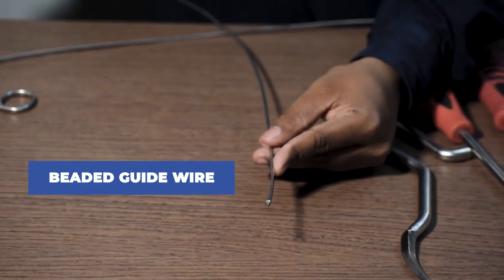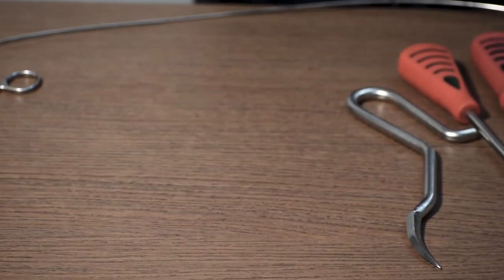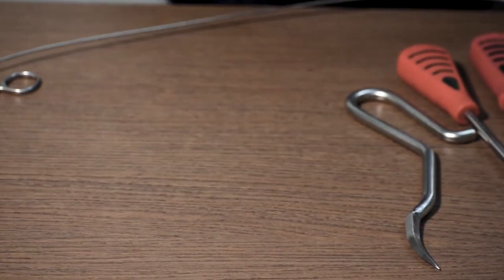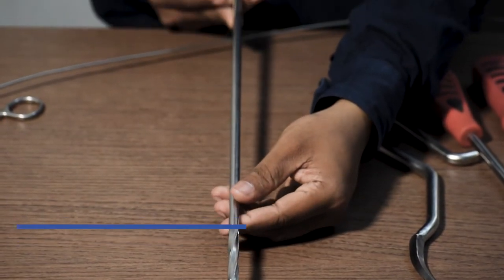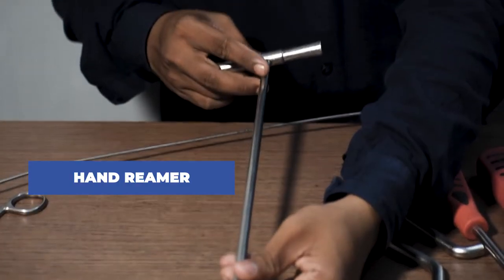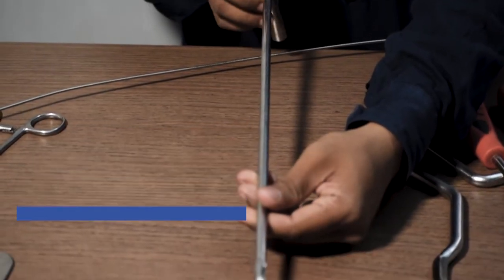Once the entry point is made, this beaded guide wire is inserted into the canal. This device is called a hand reamer. This is used to ream the canal. It also helps to understand the diameter of the canal.